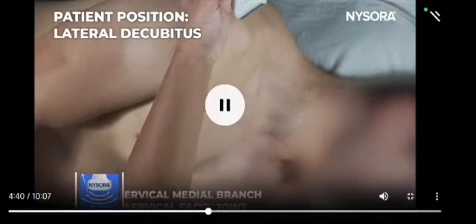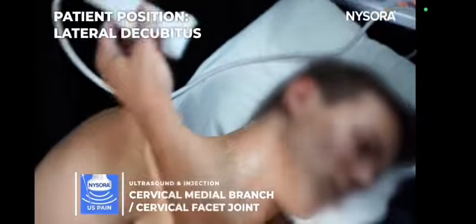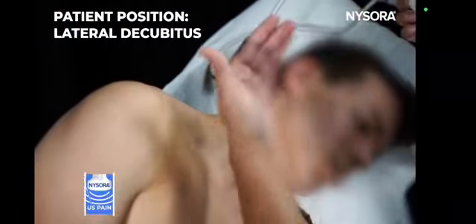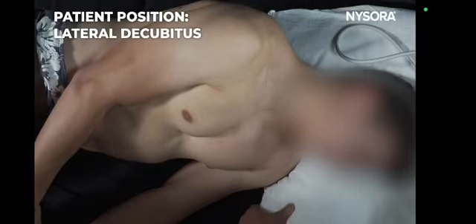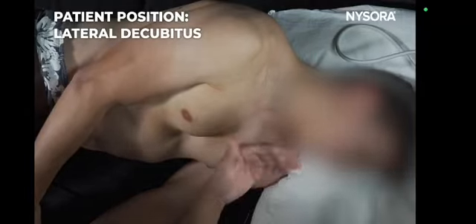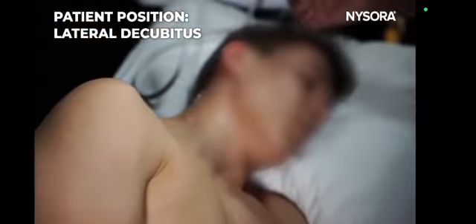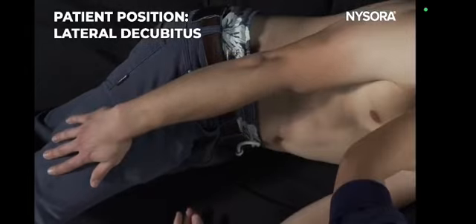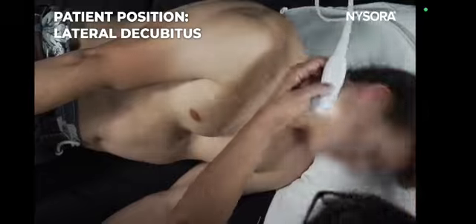So I'm going to show you how to scan for the cervical facet joint injection and the cervical facet joint medial branch block with the patient in the lateral position. So position lateral, and use a pillow under the shoulder. If the patient has a short neck, ask the patient to reach out for the knee. That way you can pull the shoulder down. That gives you the maximum operating area.